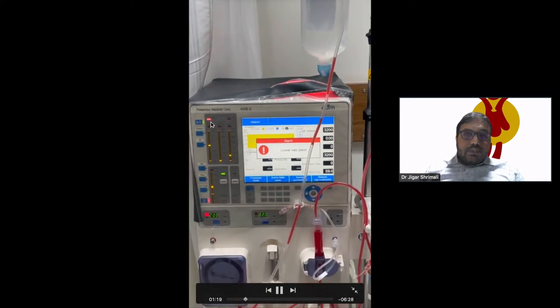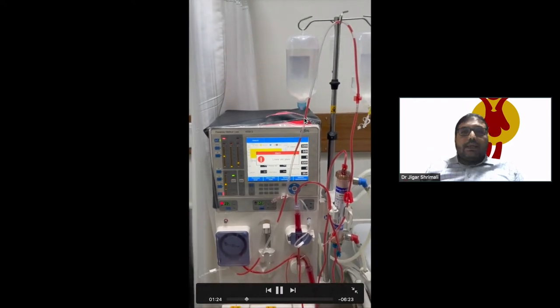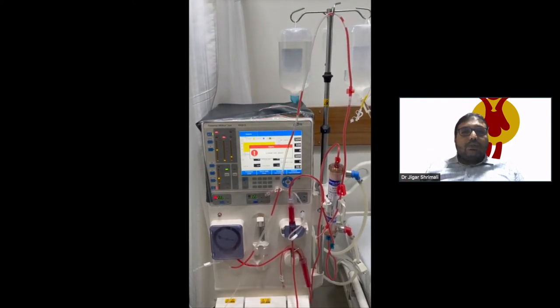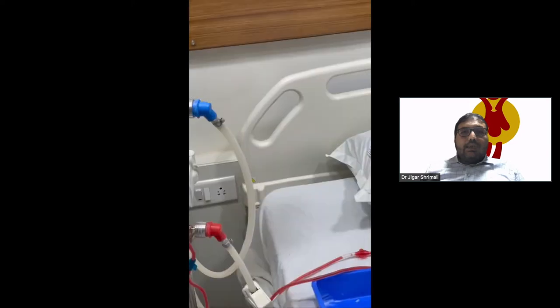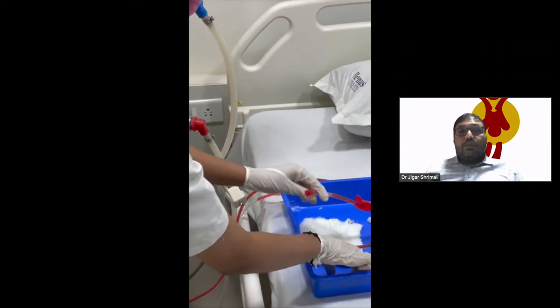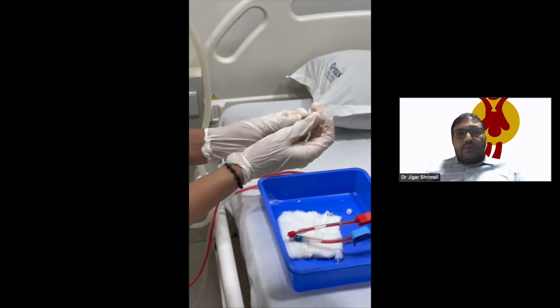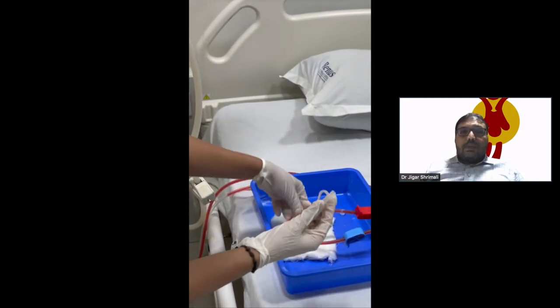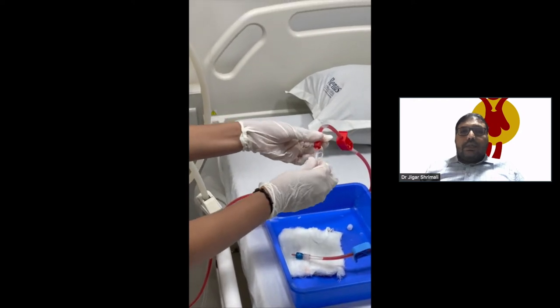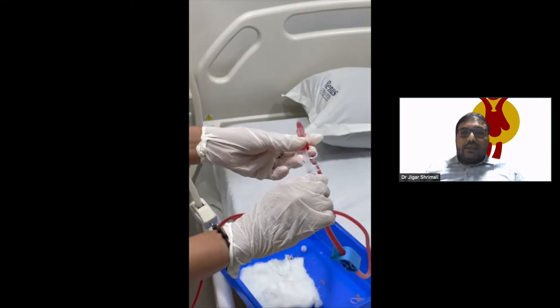The air is present in the circuit. We can see what kind of air came into the circuit. First of all, let's disconnect the patient. After that, the arterial and venous ends connect with each other through the whole circuit.